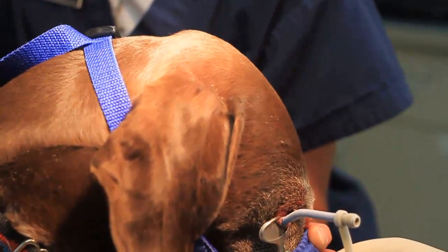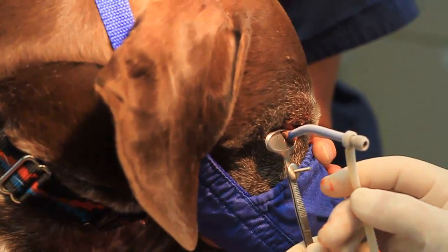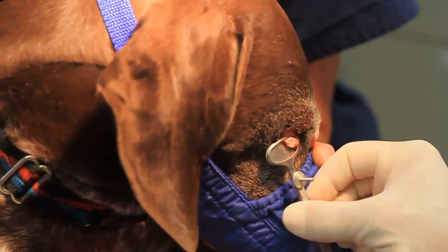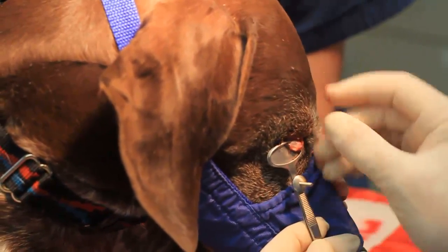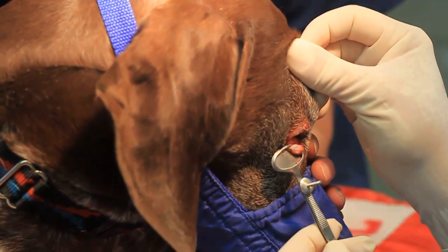This dog is probably just a little more calm than most would be. I've only had one dog that I couldn't do with just a local and a tranq — and that was a nasty rottweiler that we couldn't get out of the cage. When it turns pink there, that's when we know we can take the chalazion forcep off. Leaving the forcep on a little longer allows for a slow thaw, which gives us less recurrence.